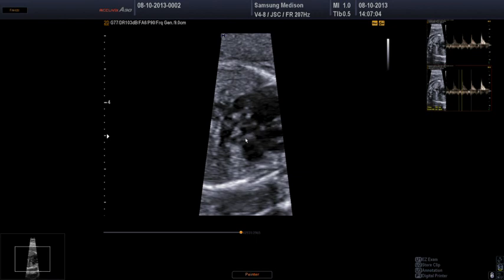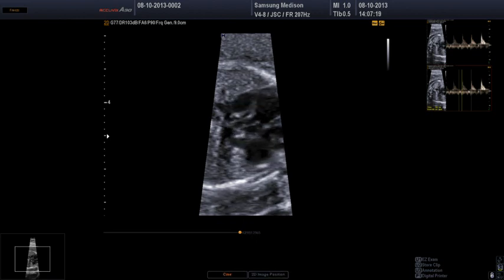That's the aortic valve. And you can see this tiny little thing here is the aortic valve closed, and it's very thin leaflet, so you only see a tiny echo in the middle. And you can slowly scroll your machine, and when that echo disappears, that is when the aortic valve opens, and you see it closing again, and you see it open, and you see it close. So that's the normal appearance of the aortic valve.